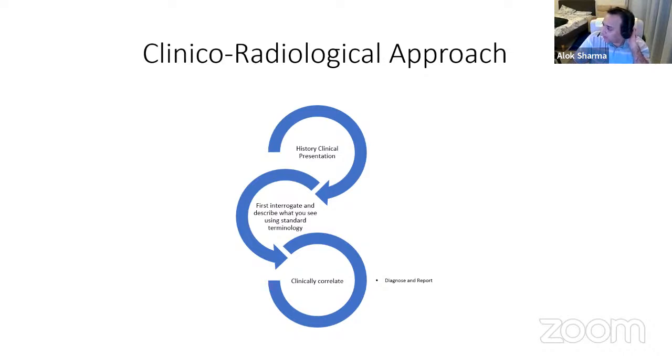I think, clinically, I wouldn't necessarily do M-mode in every region if I can see lung sliding. And I clearly think this baby's got a different pathology. Really what I'm trying to garner with an M-mode is, again, looking for a specific sign, the sinusoidal sign, or trying to look for a lung point. So that's where you have to tailor your lung ultrasound to what is happening. But at the end of the day, you have to clinically correlate and make your diagnosis. So, any questions?